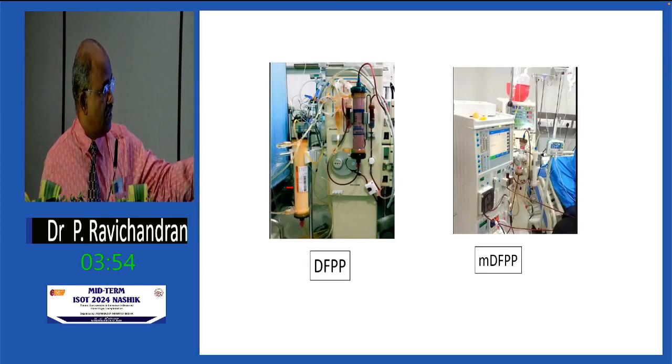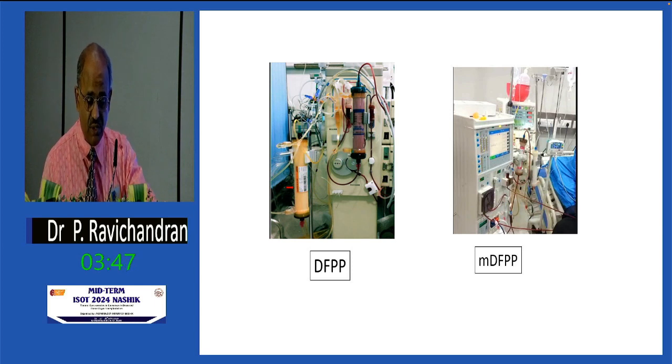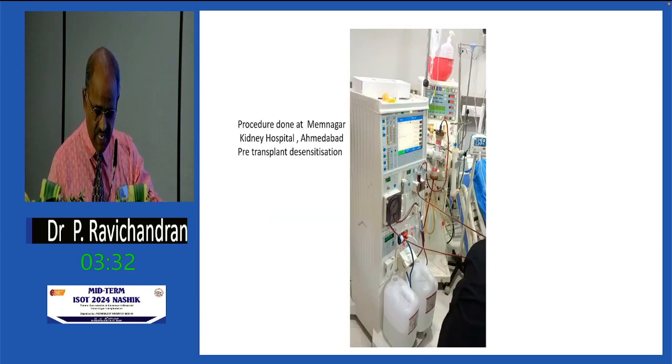So in the DFPP, Asahi plasma filters were used, whereas in the other procedure we could see 2 dialysis machines, one connected to the plasma filter, the other to the regular dialysis filter, and then the third peristaltic pump which sucks out the filtrate and pushes it back to the patient. So we have a full calculation available.